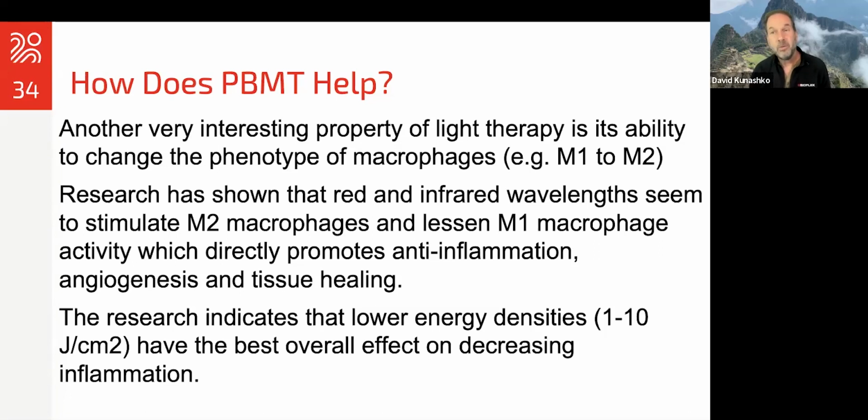So if you're overdoing it and you go, why isn't it helping, then you go to even more energy and it's still not helping, and you go, oh, it doesn't work. And class 4 uses tons of energy, like way too much energy. And it blocks pain, but it doesn't do these types of anti-inflammatory effects, even though they say it's laser therapy and they quote all the research, but all the research uses low energy. They don't use class 4.